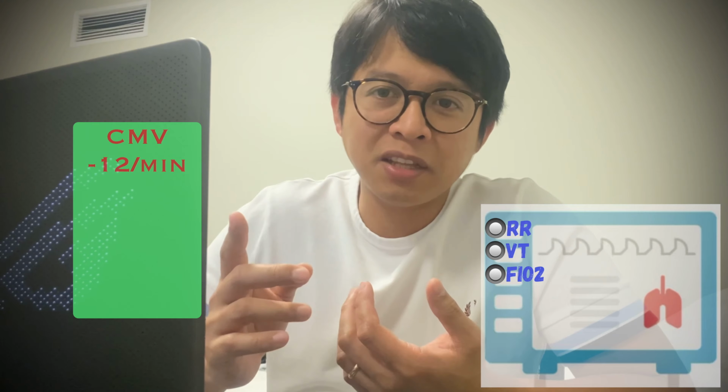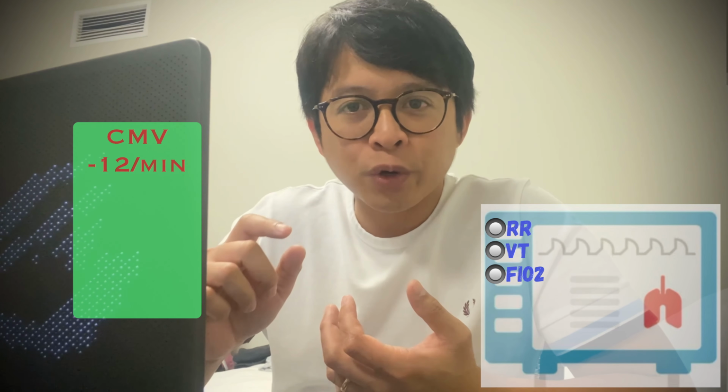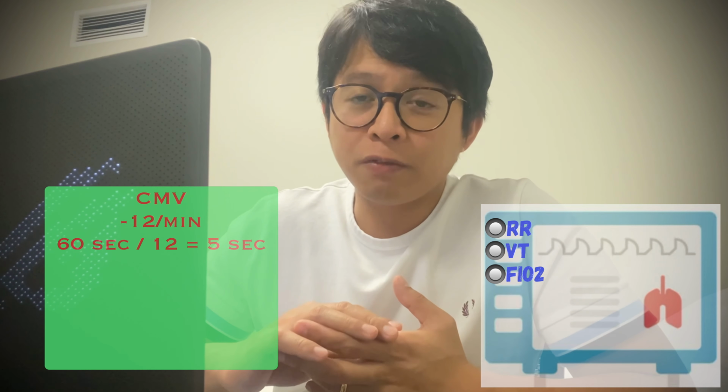Alright. The doctor orders the settings of the ventilator according to the patient's needs. Let's say the patient is not breathing. So the physician ordered mandatory mode ventilation and set the respiratory rate to 12 per minute. The ventilator will compute 60 seconds divided by 12, which equals 5 seconds.